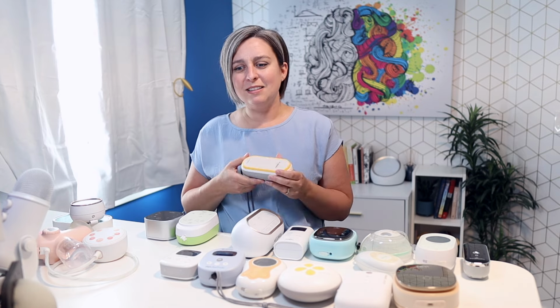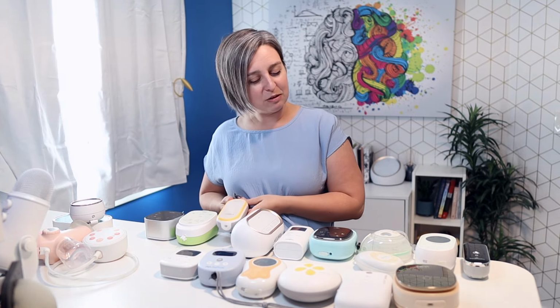And then the Dual Compact, it's beautiful, it has fast cycle speeds and stimulation mode, but that slow speed in expression mode, I think turns people off a little bit. It is very slow. The Medela Freestyle Flex, now we're down to like 3% of voters. Again, this is a nice little pump. It does tend to die pretty often, so make sure you buy it from a place that will honor the warranty. But a fine option.